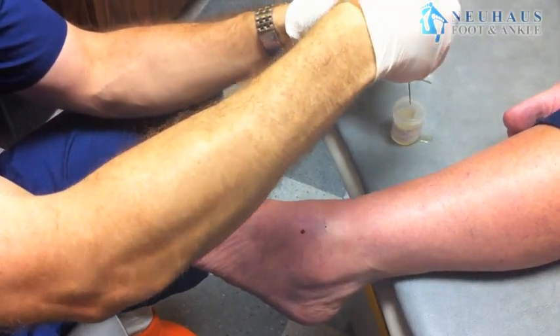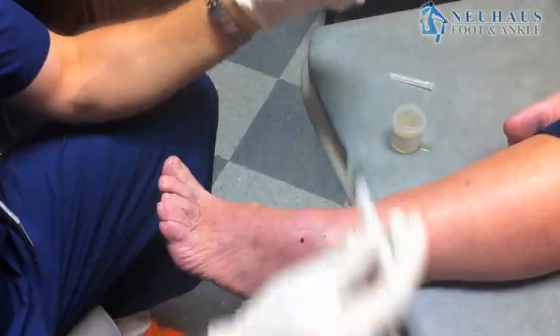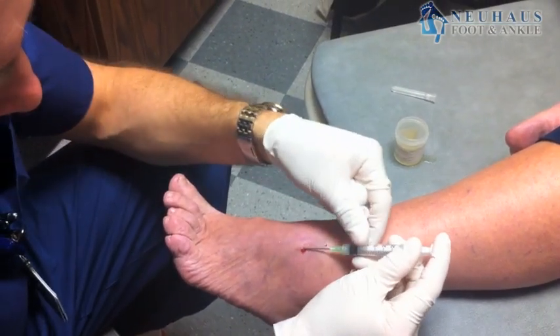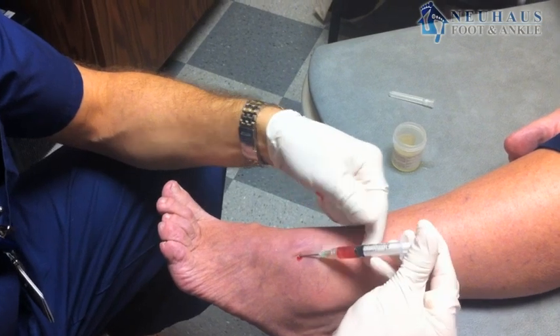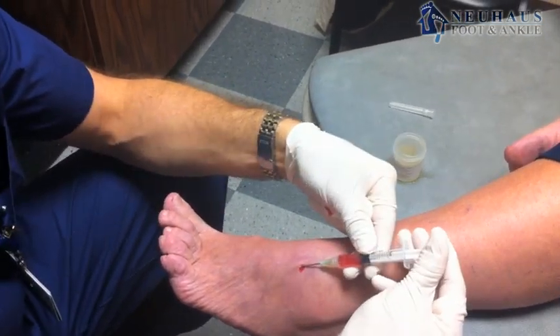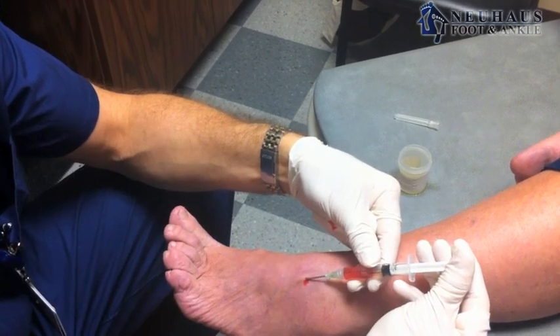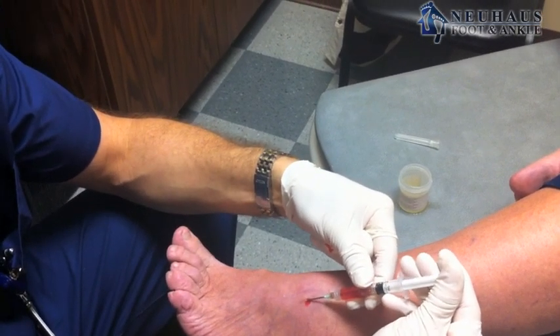It comes out almost stringy because of how thick it is. It's like a gel, almost, if you can imagine a gel — it's a very interesting fluid. It's produced by either the tendons, the tendon sheath, or the joint.